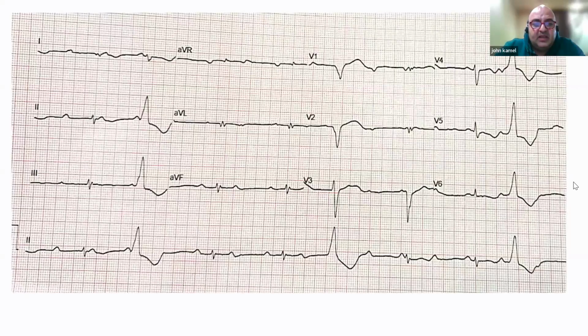As we can see, this arrival ECG shows complete heart block, complete AV dissociation, and multiple frequent PVCs. Even the PVCs have a different morphology from the two recorded tachycardias. This means there is a lot of pathology in such a patient.